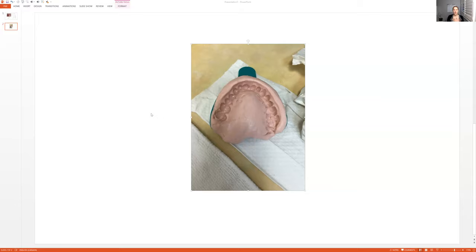Set them aside so you know which ones you will be using. Don't make the mistake like I've done before where I'll try in like three different trays. I put them all on the counter and then I go, oh shoot, which was the one that fit? And then you have to try them in again. So don't make my mistake.